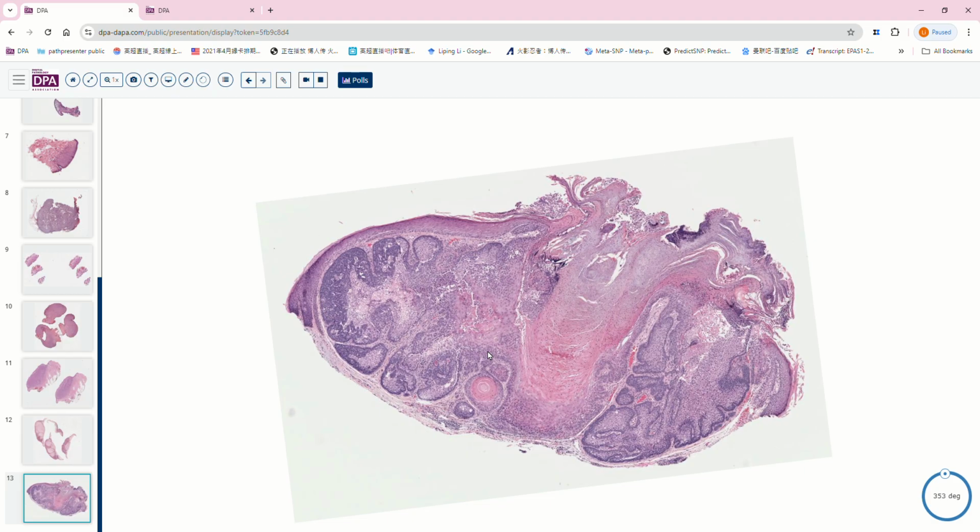First, for the Fordyce gland, that means in the lip. You should know the anatomic location. Usually in the lip, you won't see tons of sebaceous glands. If you see them, that means these sebaceous glands are in a not normal location for them, so we will call that Fordyce gland. Then the other one is sebaceous hyperplasia. As a contrast, this is a sebaceous adenoma.